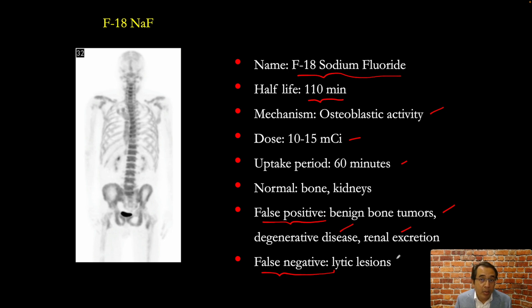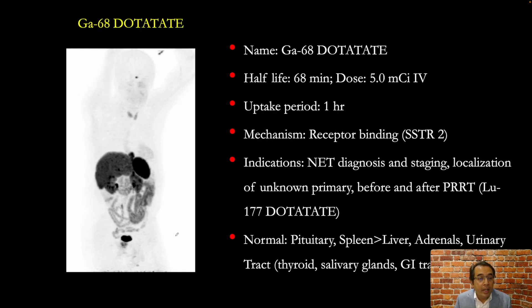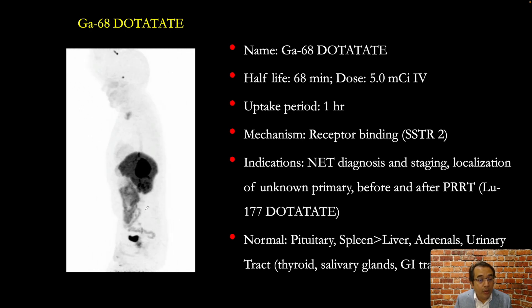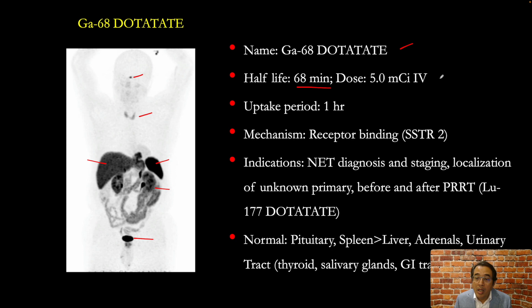This is our next study: gallium-68 dotatate. Looking at physiologic distribution of the tracer in a normal study, we see focal uptake in the pituitary, faint uptake in the thyroid, uptake in the liver and in the spleen — the spleen is normally more intense than the liver — excretion from the kidneys into the bladder, and very variable small and large bowel activity. The radiopharmaceutical is gallium-68 labeled dotatate. Gallium-68 has a half-life of 68 minutes; about five millicuries is injected intravenously and we wait for an hour.